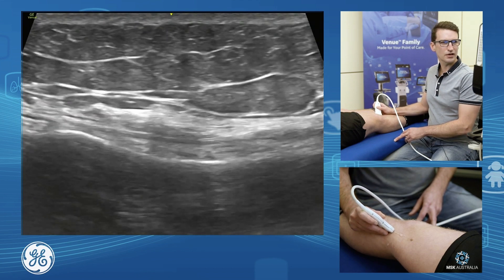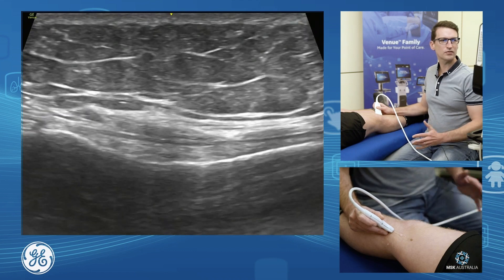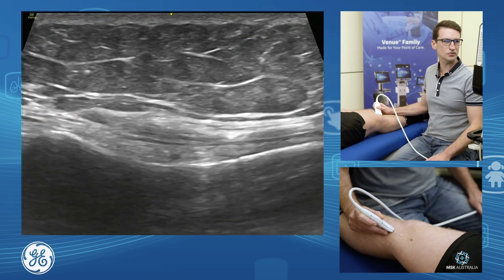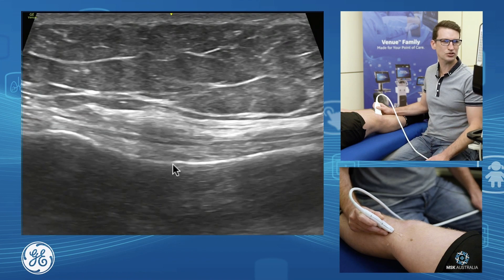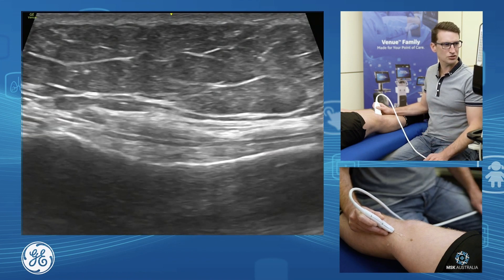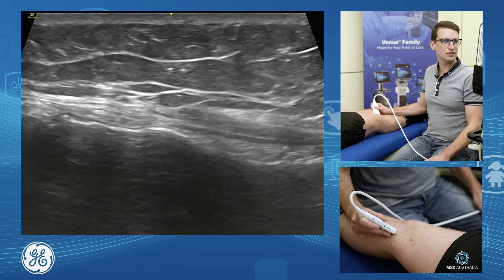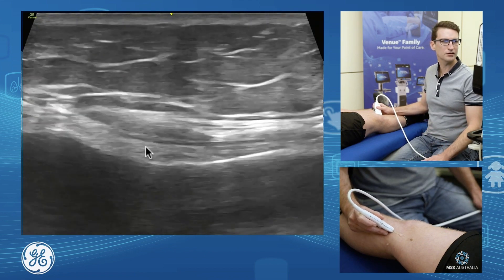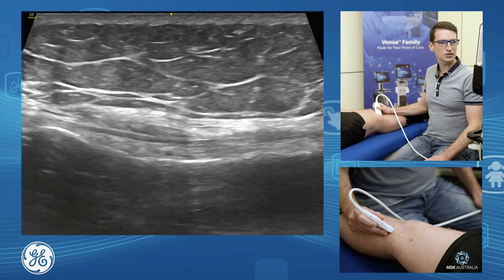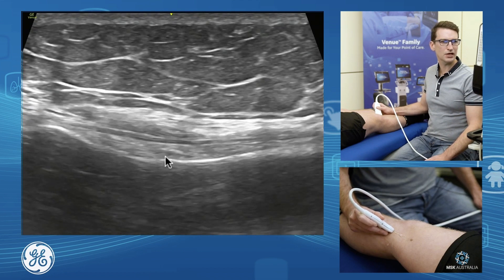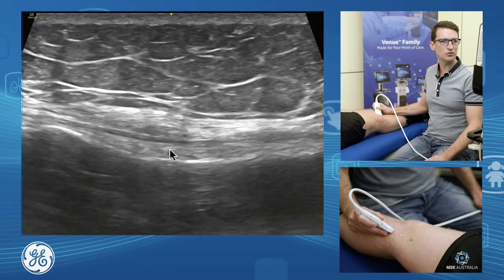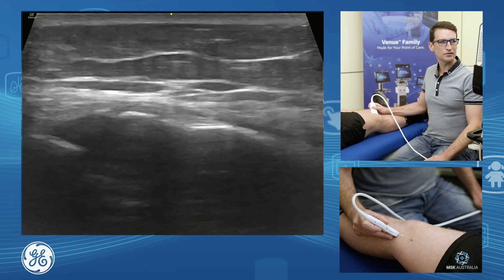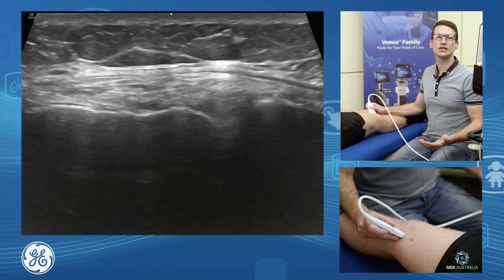If we see changes in this area, it's usually due to a secondary cause — an underlying tibial stress fracture or a rheumatological condition. Sometimes if there's injury to our medial meniscus, we may have some fluid tracking down into this region. You can see just deep to the ligament here is our inferomedial genicular artery and neurovascular bundle, just pulsing away there. That is our medial knee.